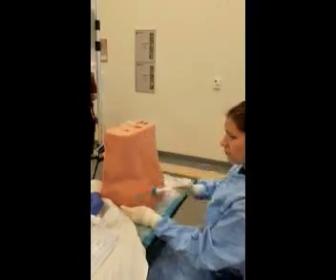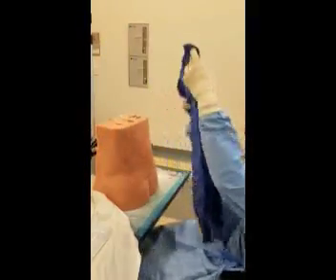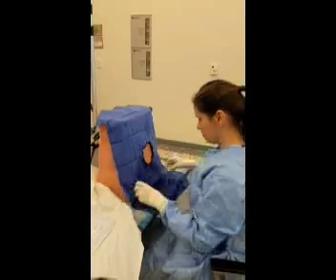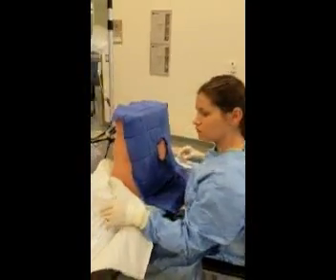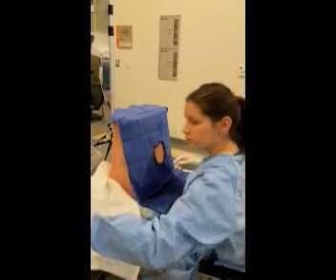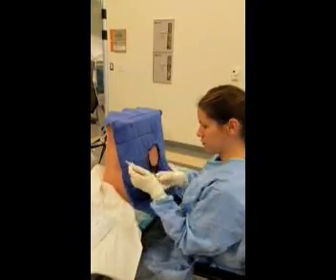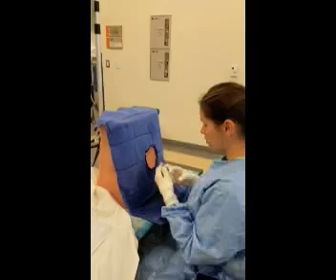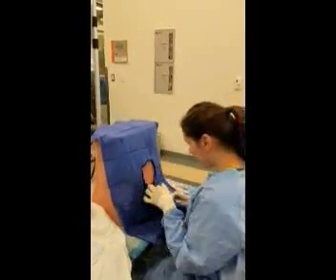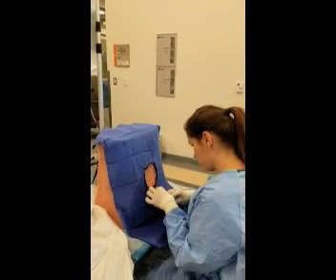Next, place the fenestrated drape over the marked area of the patient's back. Make sure sample tubes are within easy reach and are placed in proper order. Prepare anesthetic lidocaine in a 3 ml syringe with needle, rechecking the position through the drape to repeat identification of L4 and make sure you're in the right space. Placing the needle just under the skin overlying your marked interspace insertion site, create a wheal of anesthetic and insert the needle into the interspace and continue to inject the anesthetic. Withdraw with a quick, smooth motion.